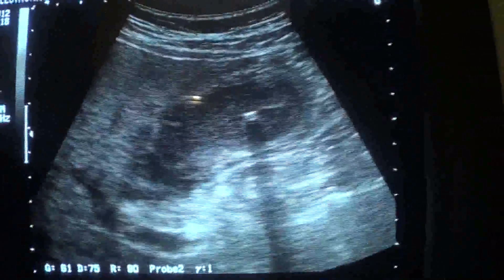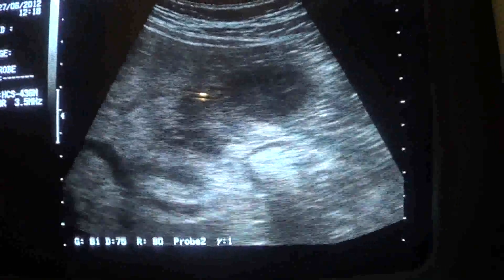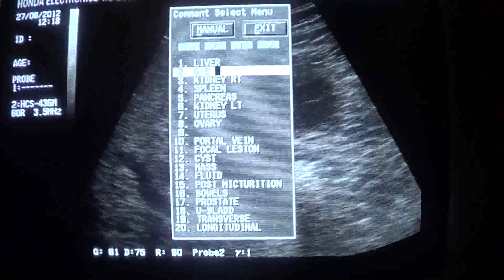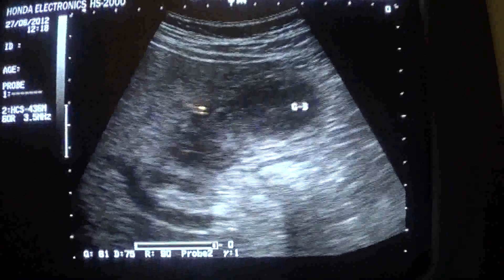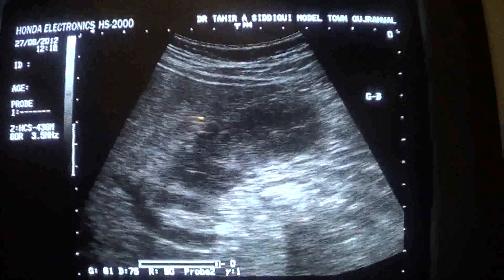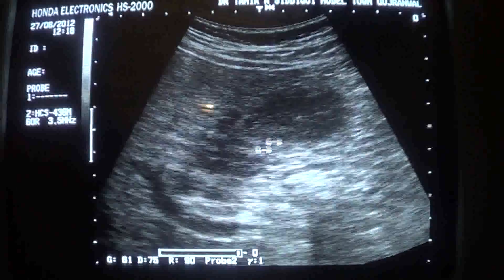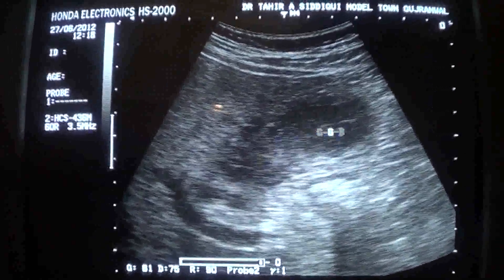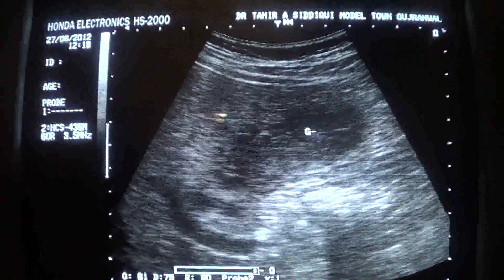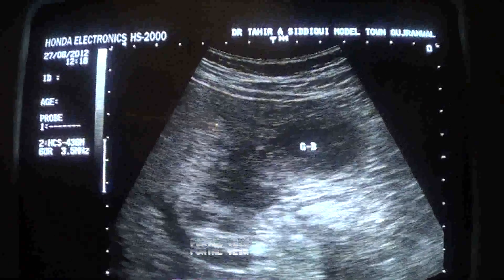This is an ultrasound of the gallbladder filled with sludge. The lumen should have been as black as this area, but instead the lumen is filled with mixed-level echogenic particles. This is the sludge in the gallbladder. Now this is the portal vein, the landmark for identification of the portal vein.